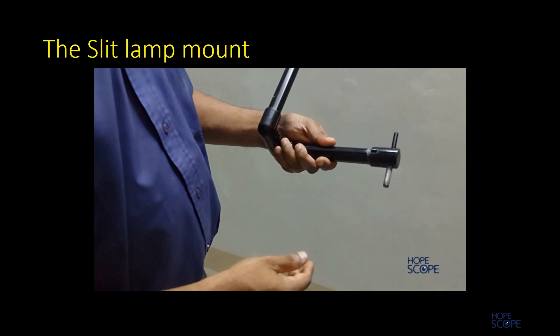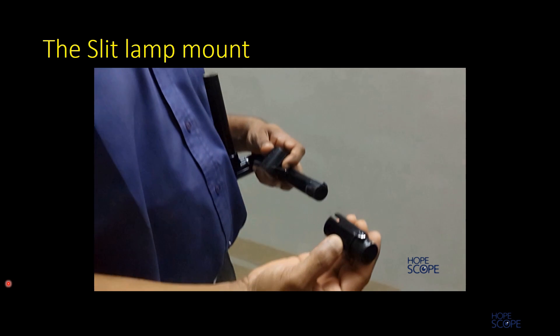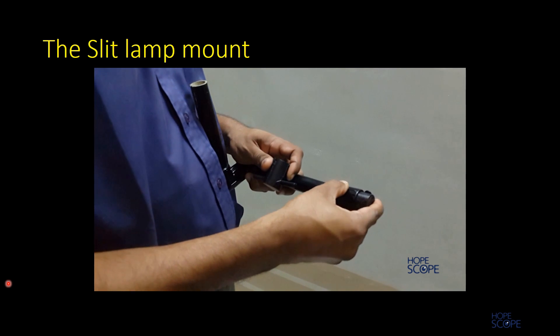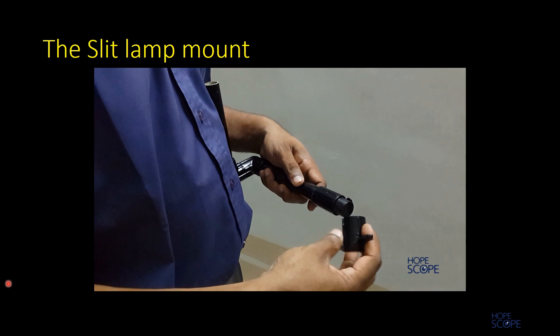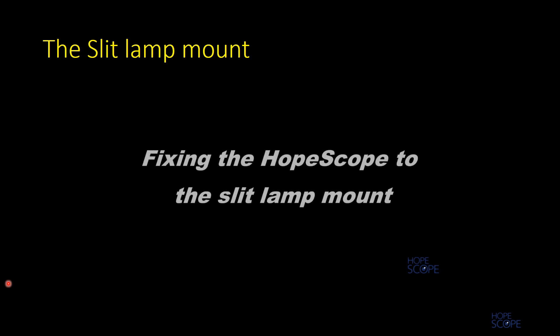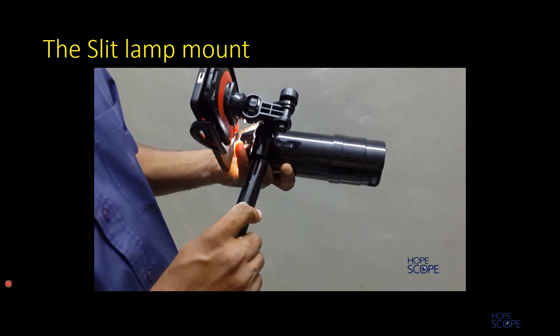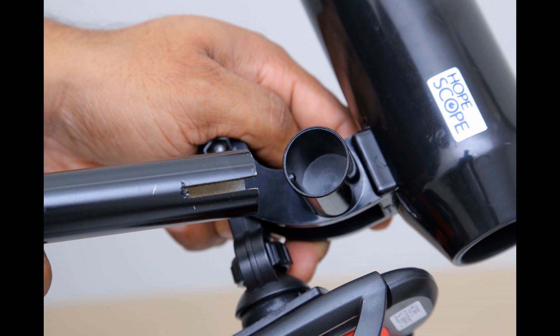Setting the slit lamp mount is easy. The first step is to place the pin assembly onto the mount. In case you are using an expander for the optical tube, one needs to use the extender for the slit lamp mount to increase the length and compensate for the increased length of the optical tube, and then place the pin assembly. The slit lamp mount is then fixed to the HopeScope, with grooves guiding the correct alignment.